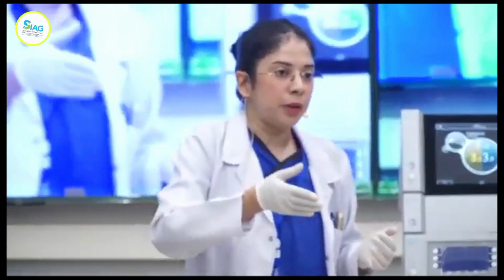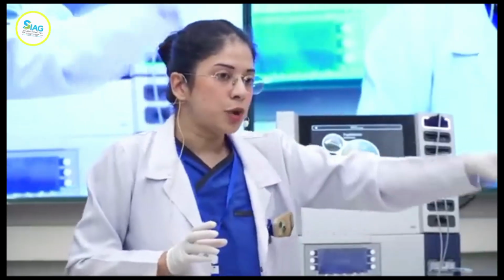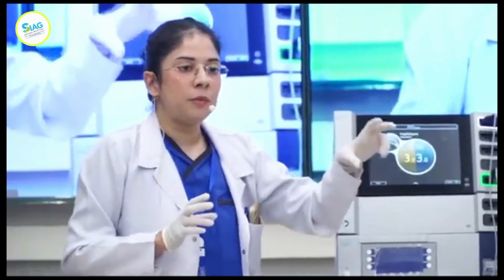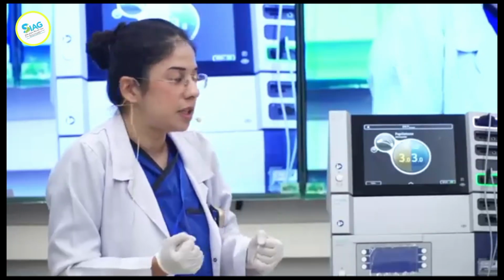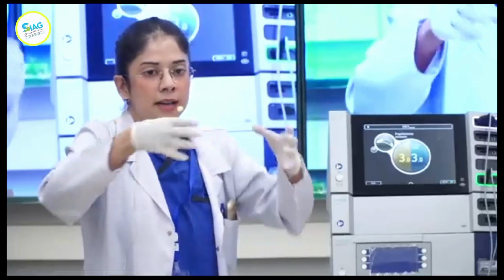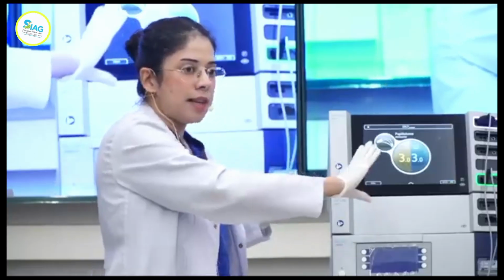But in our field, we're dealing with resistance, different types of resistance. A large polyp, which is 3 centimeters, will have more resistance than a polyp which is diminutive. A small papilla will be very easy to cut, as opposed to a very floppy ampulla where you find it difficult that it's just not slicing fast enough. So you notice that it's a very bulky tissue. And again, in POEM, the different areas that you're cutting, the depth of the tissue, the amount of tissue that you have, you might require stronger force. So that's where the other settings work.